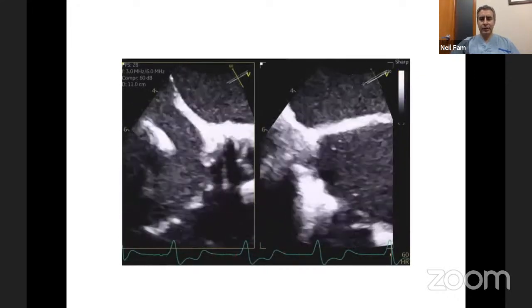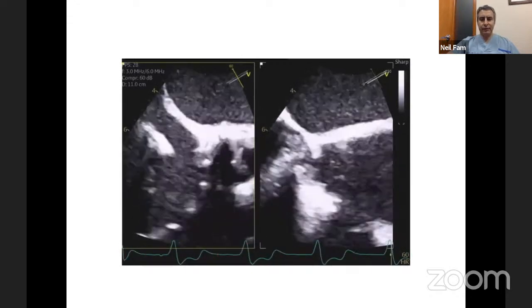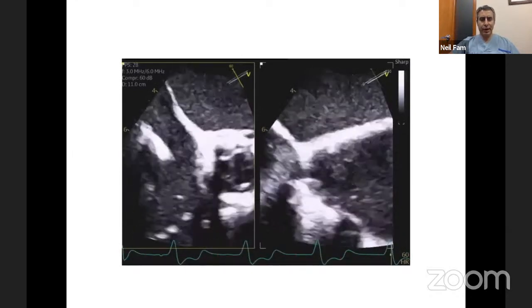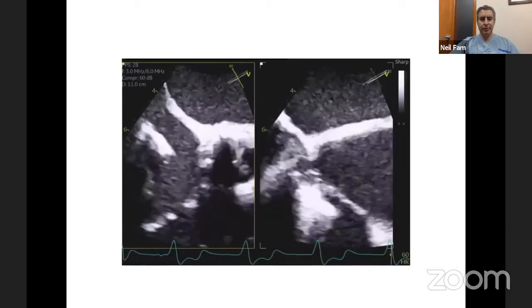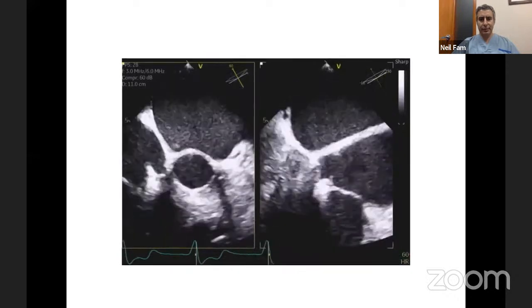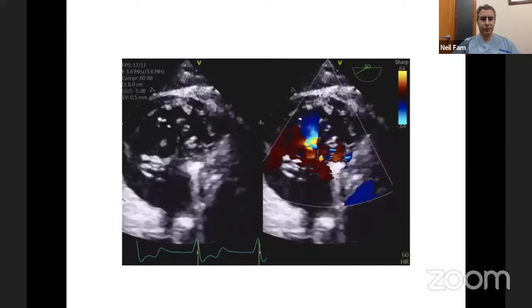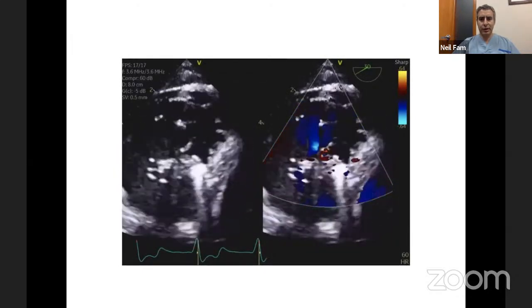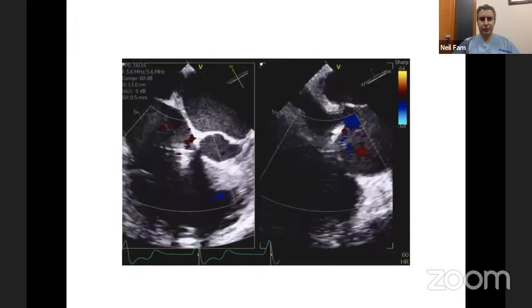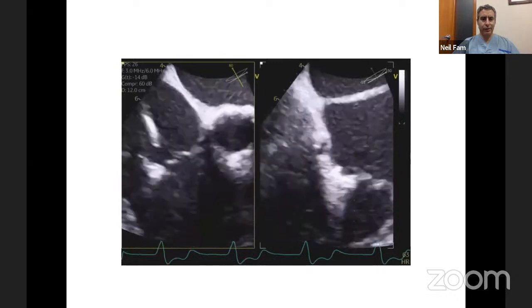So after successfully treating the mitral valve, we approached the tricuspid valve. Our default clip, whenever possible now, is the XTW, which we can discuss in more detail. So the first target is anteroseptal, and there's the first clip deployed. You can see a tissue bridge there, anteroseptal commissure, residual TR in the center of the valve. And so there's a target to place a second clip posteroseptal, so another XTW.